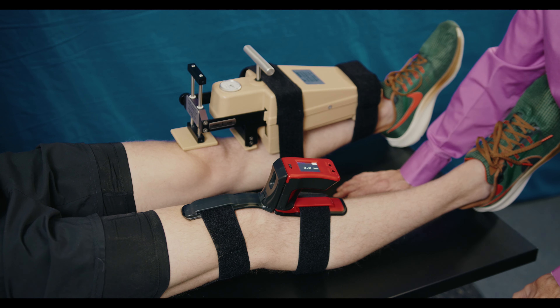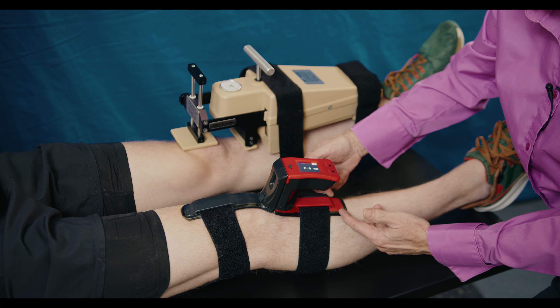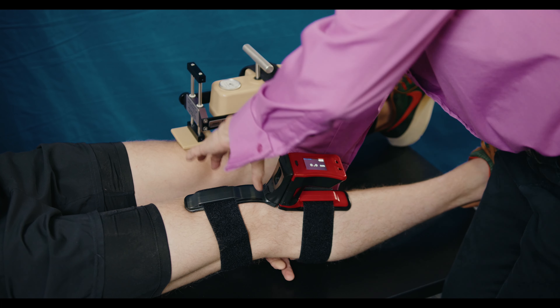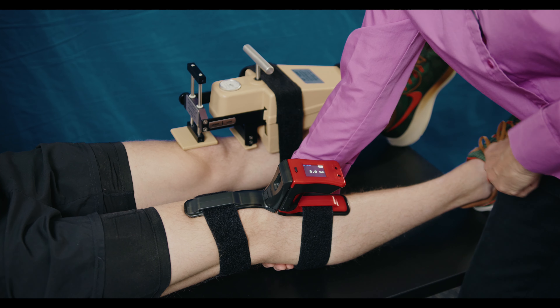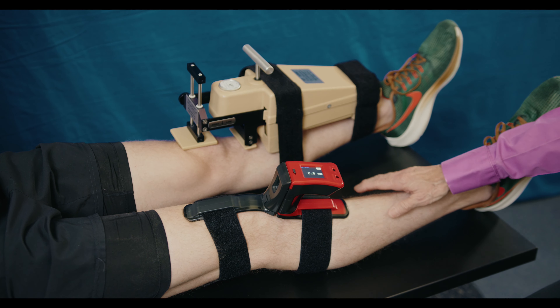It's an arthrometer that tests knee laxity. We simply put on straps, contour the device to the knee, position, and anteriorly translate the tibia on the femur. The best part is that we get an immediate objective value of the exact translation of the tibia to assess the ACL laxity.